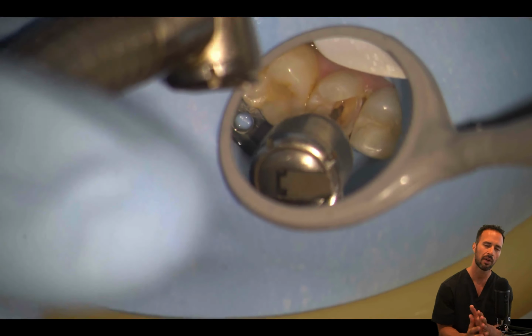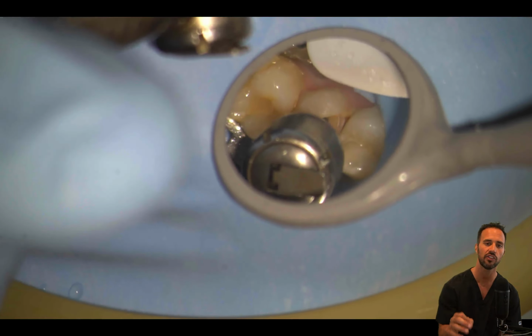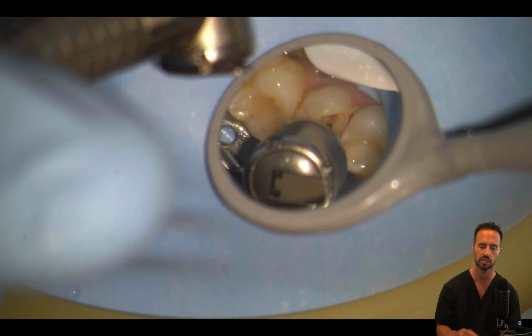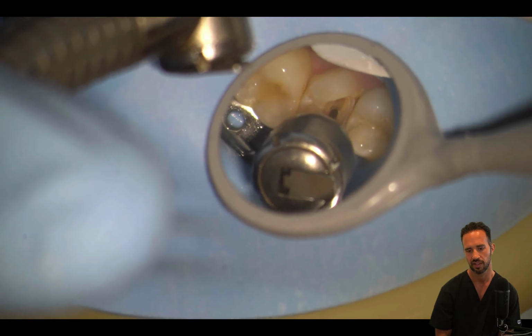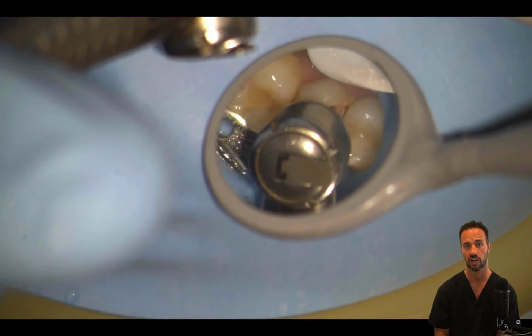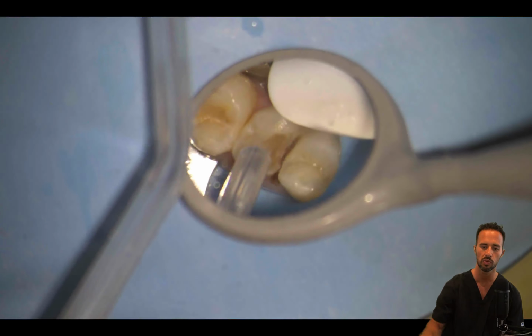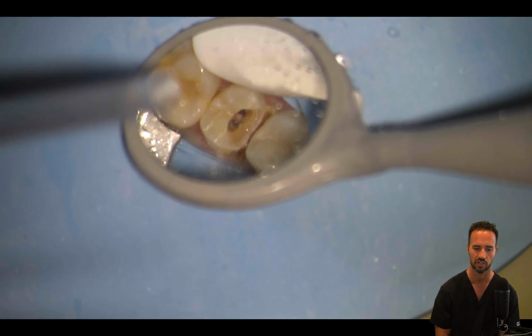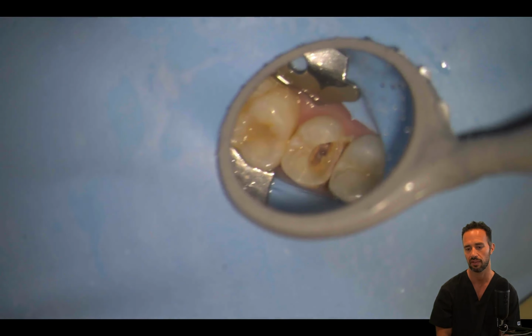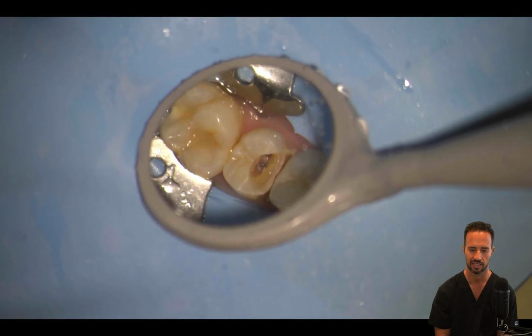And now we're just modifying our access prep and making some fine tuning using the Endo Z burr. Like I mentioned, the Endo Z is a non-end cutting burr, and it's used to just round off the internal aspect and give you that final shape of the access preparation that you're trying to accomplish. Okay, so just a back and forth action to give you some nice smooth angles inside that access preparation. But you can see very clearly there we have two canals present, the buccal and the palatal canal. Okay, so it's starting to look nice and clean.